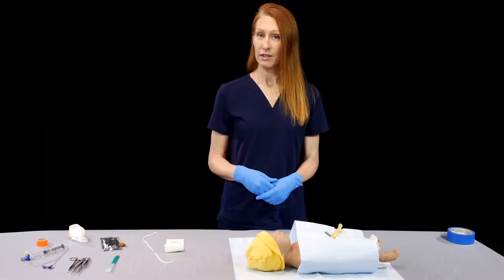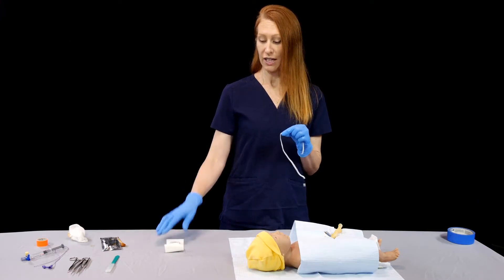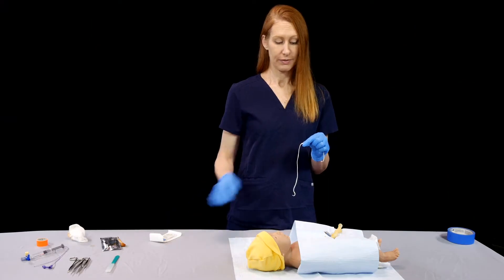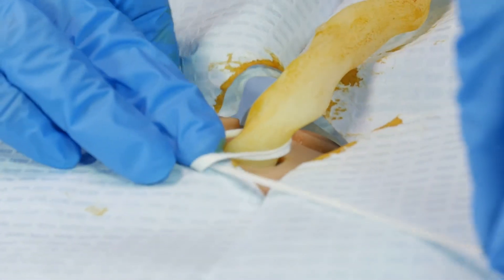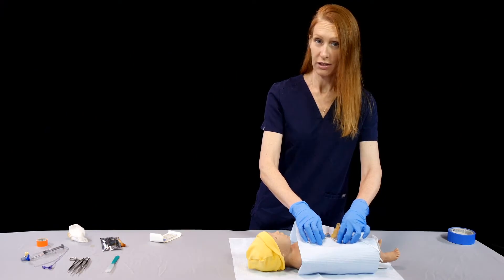Next, we're going to wrap the umbilical tape at the base of the umbilicus. If you don't have umbilical tape, you can certainly use a suture instead. I've closed this with a knot that I can secure once I have my line in place. I don't want it too tight at this point because it might keep me from advancing my line.